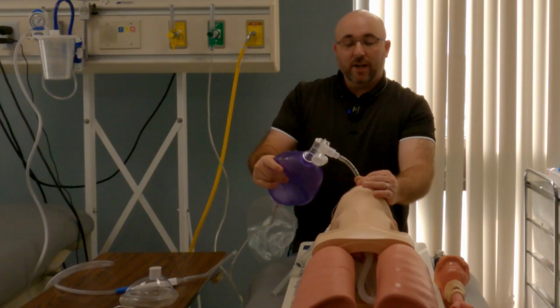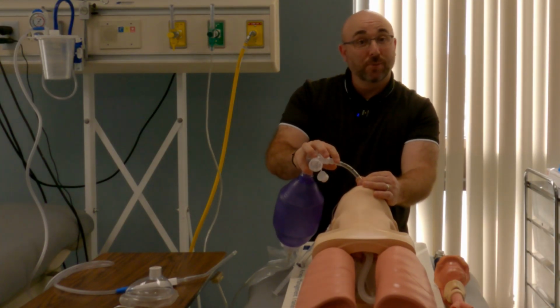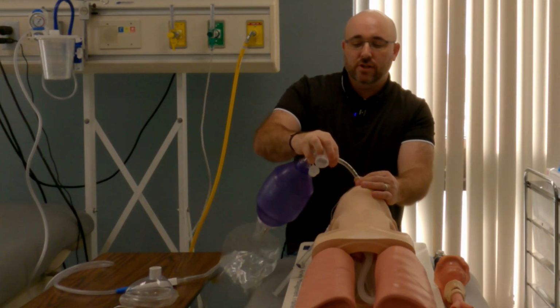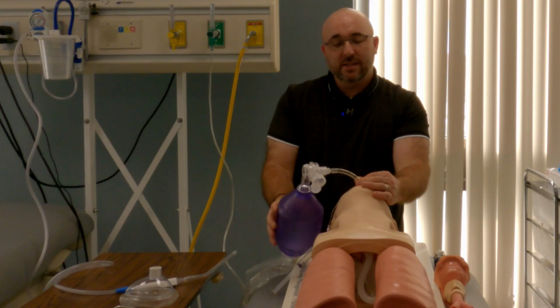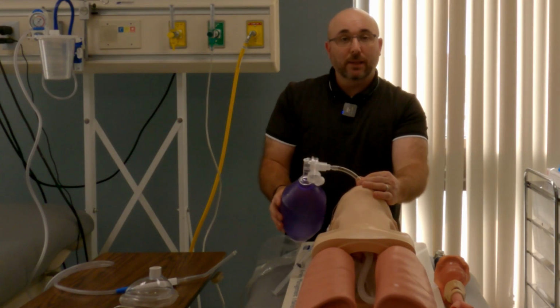So we're going to give a couple breaths. You're going to listen to that. You're going to see change of end-tidal CO2. That's another piece that actually comes with the bag valve mask, end-tidal CO2. And then now we're at the point where we can ventilate the patient.